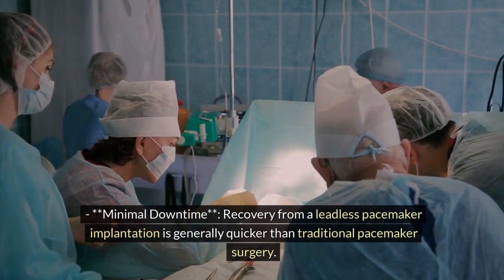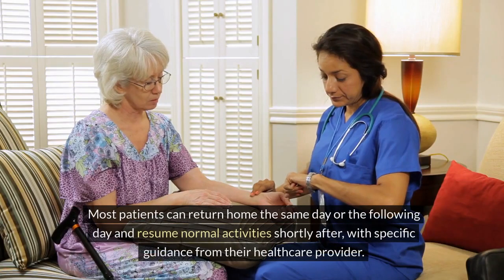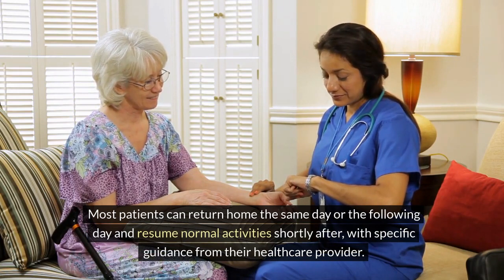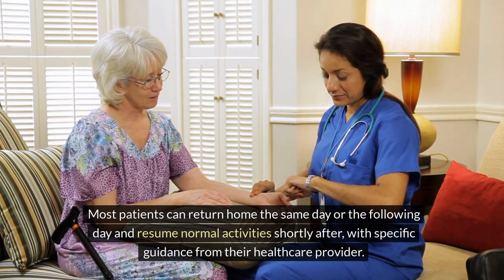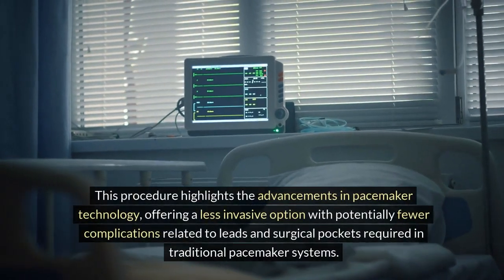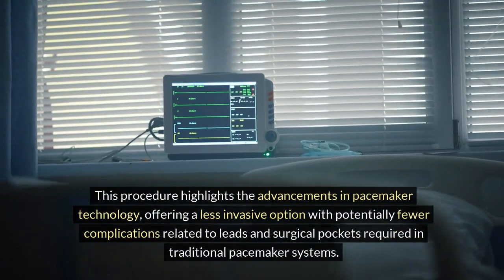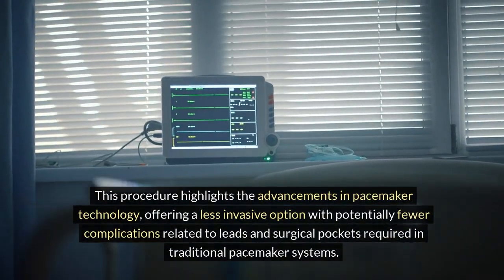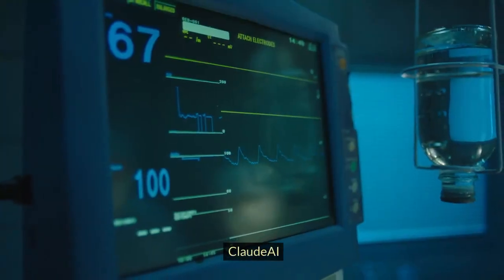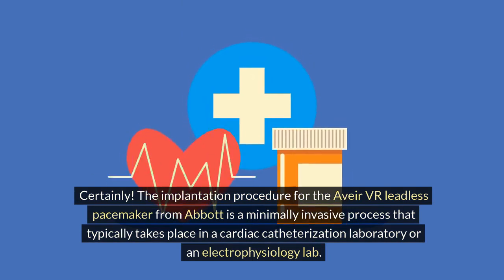Step 6: Recovery. Minimal downtime: recovery from a leadless pacemaker implantation is generally quicker than traditional pacemaker surgery. Most patients can return home the same day or the following day and resume normal activities shortly after, with specific guidance from their healthcare provider. This procedure highlights the advancements in pacemaker technology, offering a less invasive option with potentially fewer complications related to leads and surgical pockets.